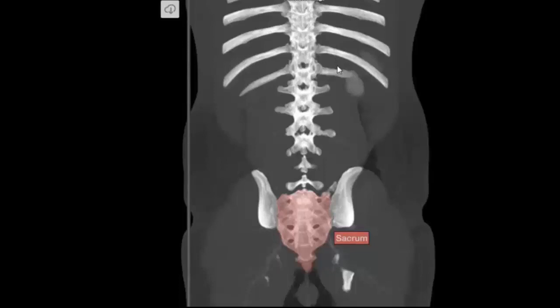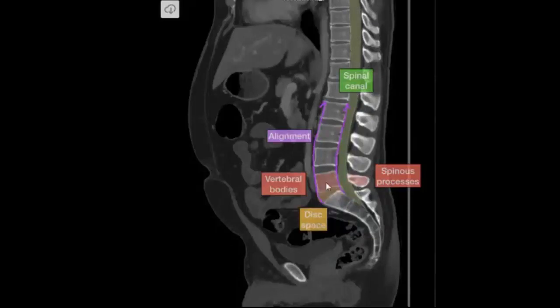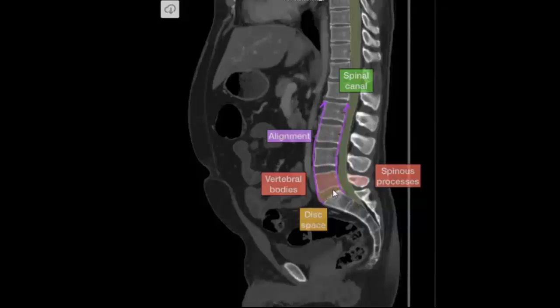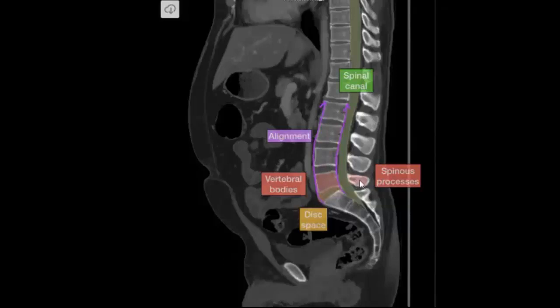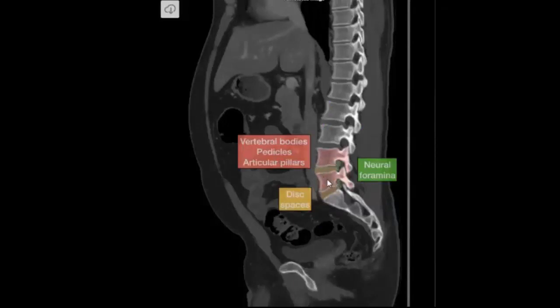Spinal cord, vertebral bodies, intervertebral discs, spinal cord, vertebral bodies, intervertebral discs.